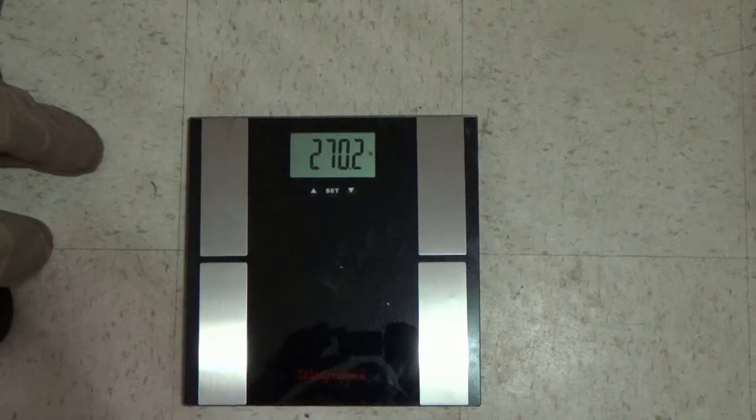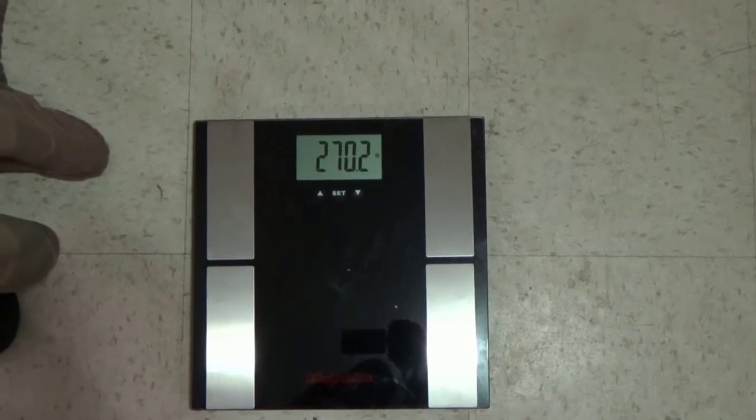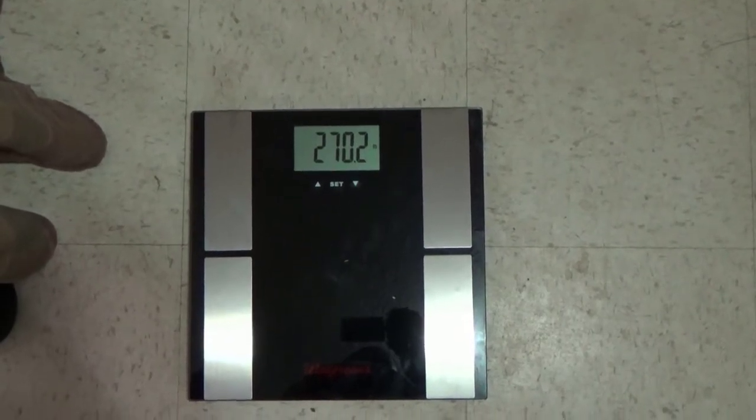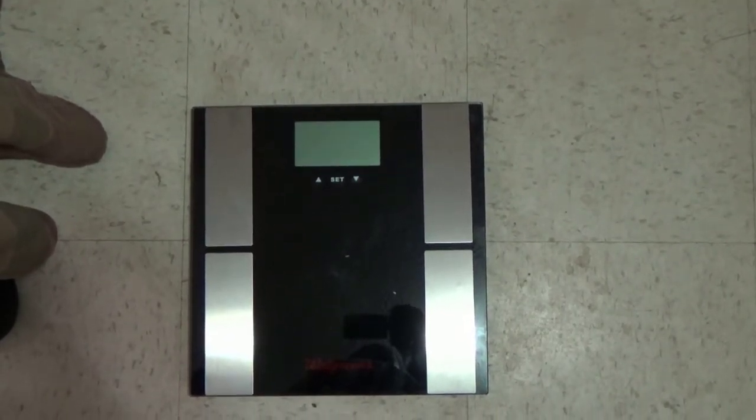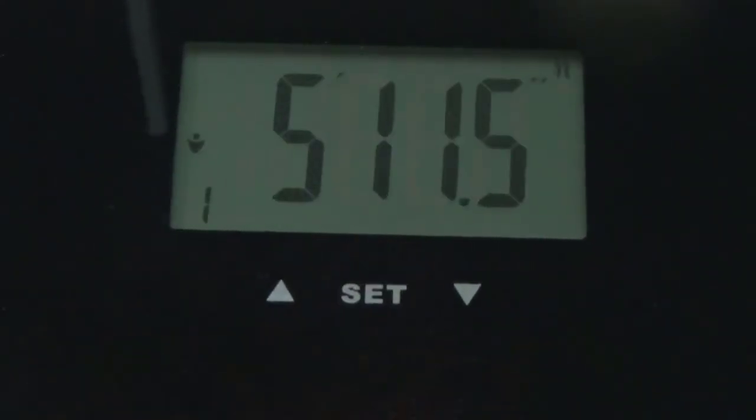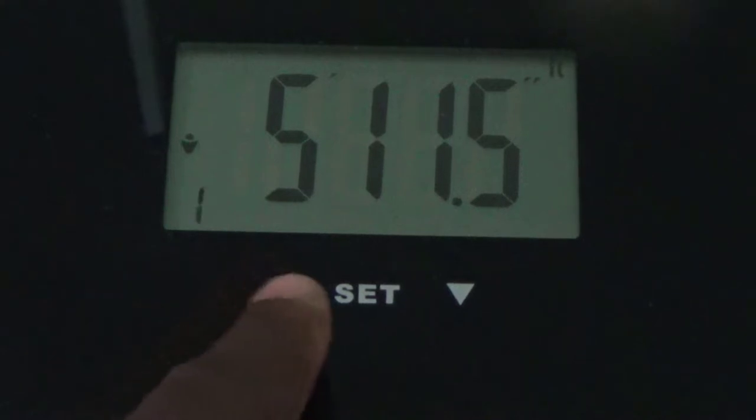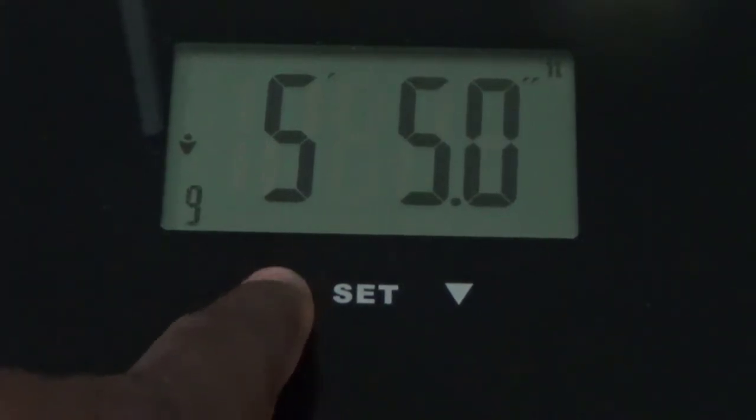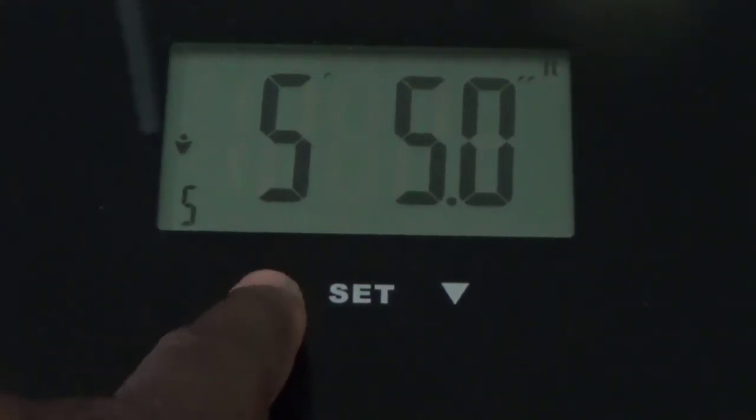And what you can also do with this is program settings like ten different settings. I'm gonna show you how to do that. Just hit the set button. You got person one, person two, three, four, so you could program up to ten different people.